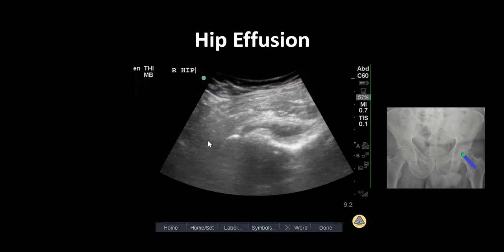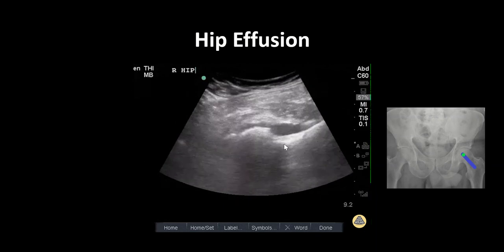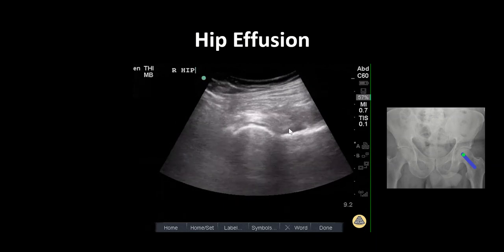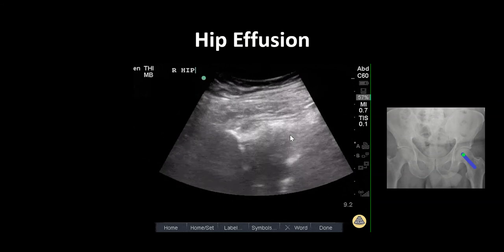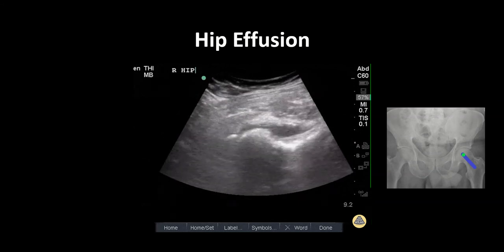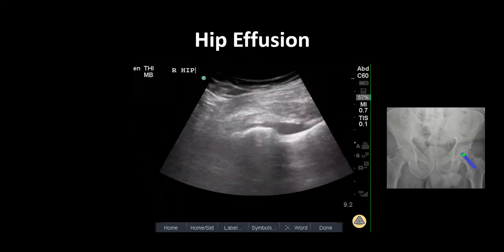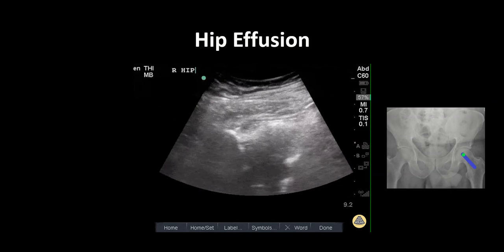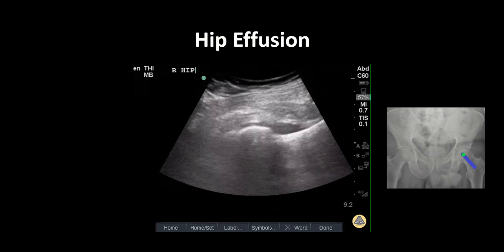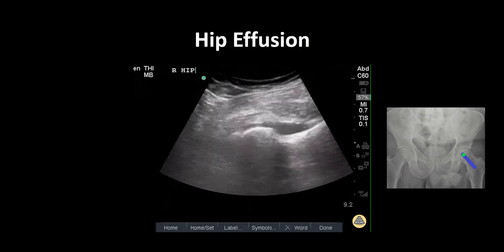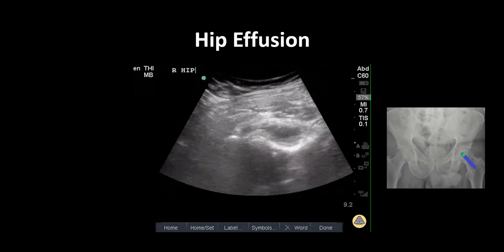Here, we see the femoral head and neck with an anechoic stripe of fluid above the femoral neck in an area called the anterior synovial recess. This is our hip effusion. The diagnostic criteria for a pathologic effusion is a fluid stripe greater than 5 mm or a discrepancy of more than 2 mm from the unaffected leg.